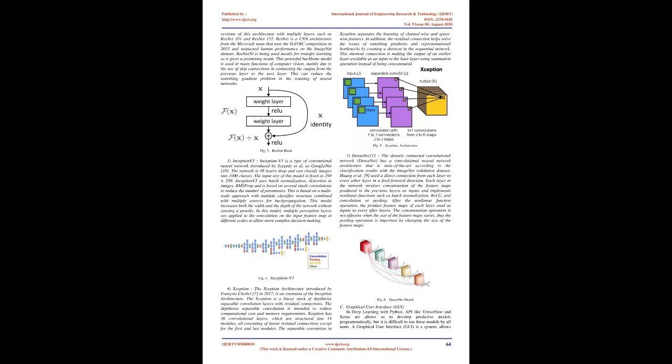3. Methodology. A. Data preprocessing. Data preprocessing is a collection of techniques to improve training data. It is used to convert raw data into efficient and useful data. In this research, data was collected from 2 different sources and then built into a single collection. The collection consists of 3 classes of chest X-ray, CXR, images: COVID, pneumonia, and normal.